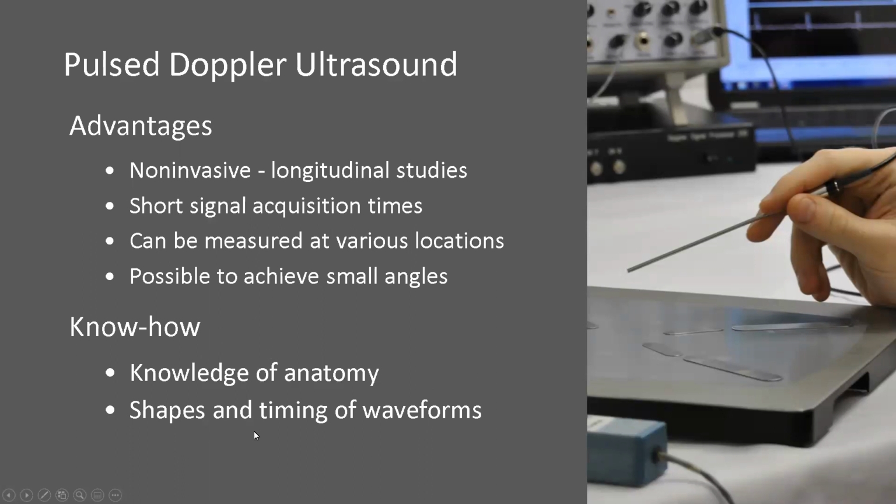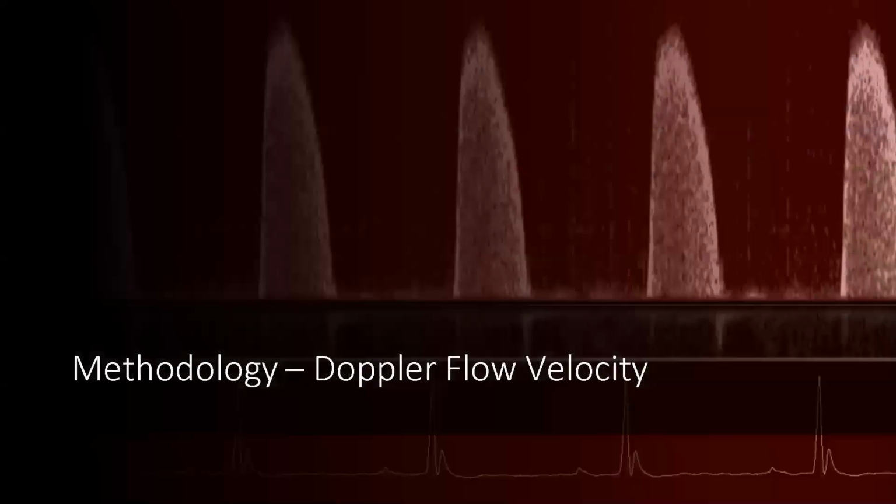And the key thing in using pulse Doppler is knowledge of anatomy. So you need to know where the vessels are with respect to the surface of the skin. It also helps to know the shape and timing of waveforms. That way you can recognize if you are at the right site or not. I just want to remind you, this is not an echocardiography system. And we're going to get into the methodology.